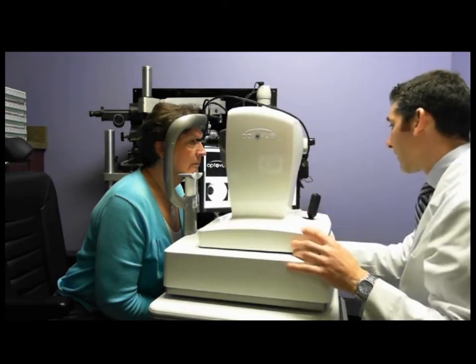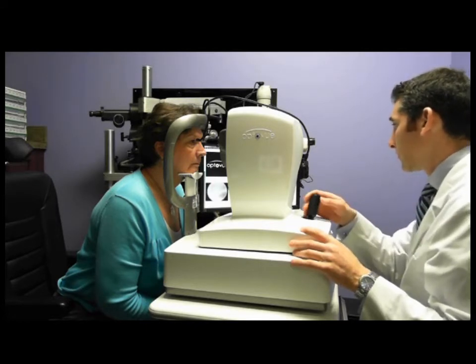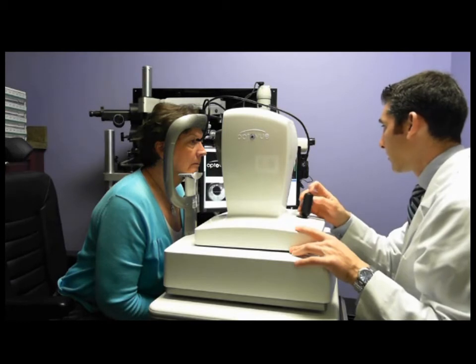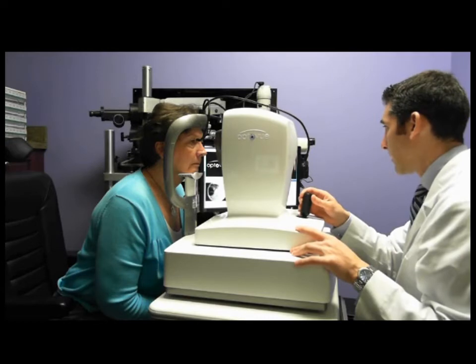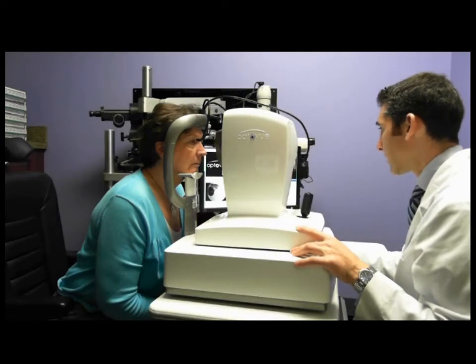Okay. Let's take a look at the other eye. With the OCT, I'm trying to judge the amount of vault. And I'm also looking for any areas where the posterior surface of that lens is impinging on the cornea. Okay, and on the left eye, we can see we have excessive vault, which is likely to decrease the visual acuity once we have our over-refraction in place.